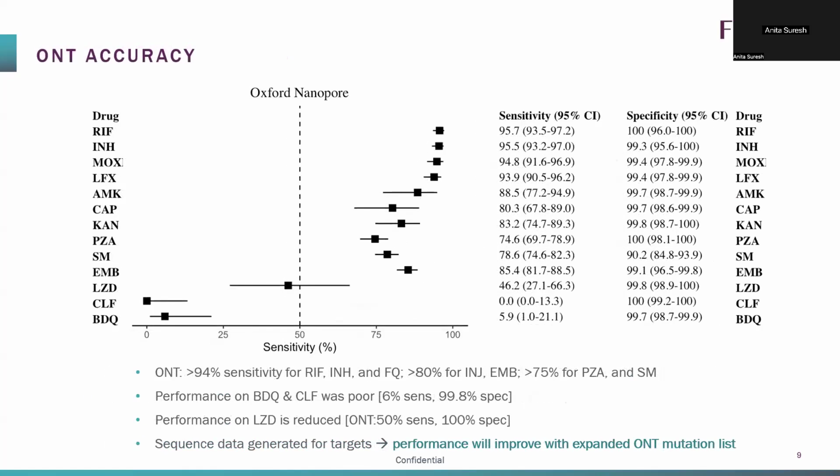So with ONT, it becomes even clearer. You'll see all of these for the top drugs are definitely high sensitivity. You're seeing the drop off very similar to linezolid, which suggests that maybe that's where you can get today with a molecular test. So that's something that is being looked into further.